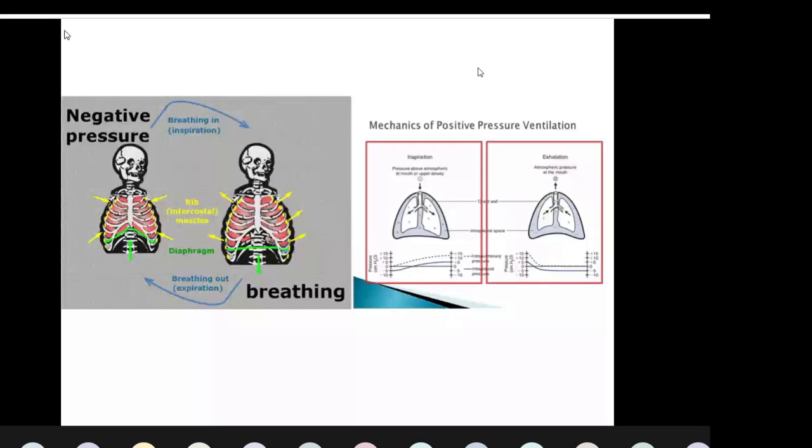Now the problem comes when your body is not ready to accept what is being given between your lung, body, and the machine. That's the sole problem of a mechanical ventilation or invasive ventilation. We come to that in detail.